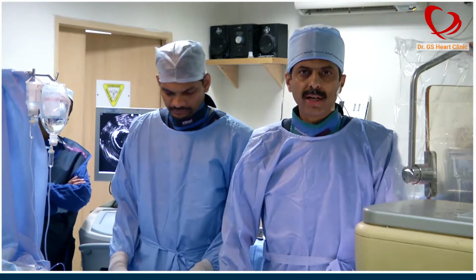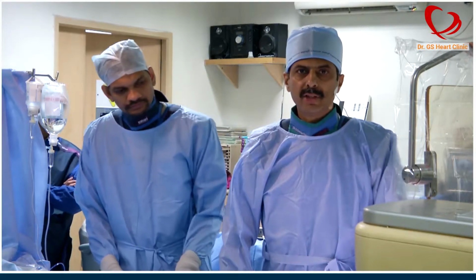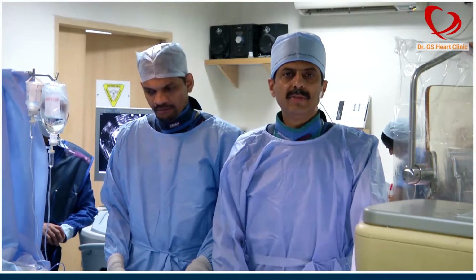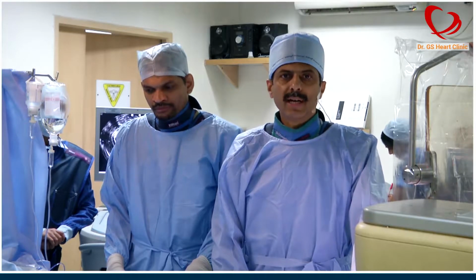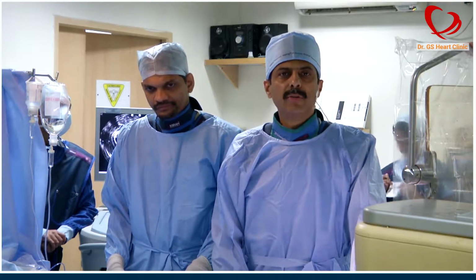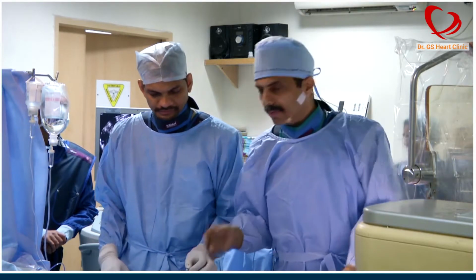And our hardware, we have taken the right radial approach, she has taken the 7 French sheath. So we plan a 7 French guide and take a 7 French EBU guiding catheter. We would definitely like to take a 7 French in this case, because we might have to do some strategies for the left main, which may involve placing multiple balloons and stents. So I would prefer to have a 7 French in place. So we will proceed to the case now.